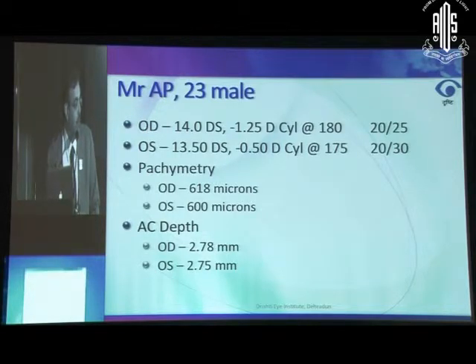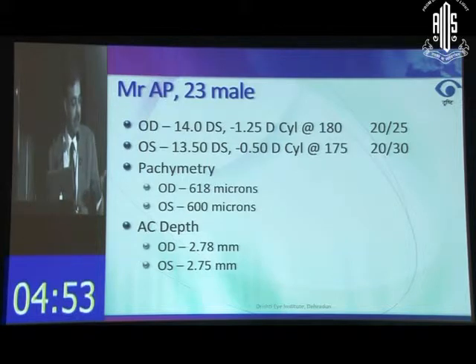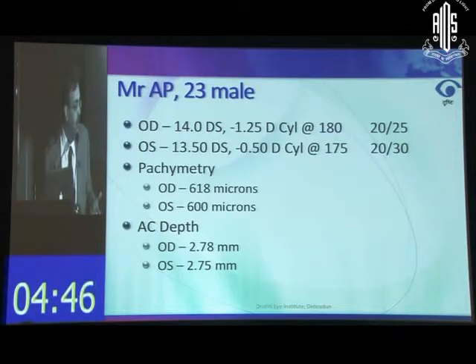12 microns. Yeah, but I'm a little confused. If you have excellent thickness cornea, and if you do a flap of 90 microns, let's presume that, you're still at a good safety level. I know. So theoretically speaking, Kumar, you have 200 microns available for ablation, right? Which means you could actually go up to 20 diopters. But that's all theoretical. So practically, how much would be the maximum correction?